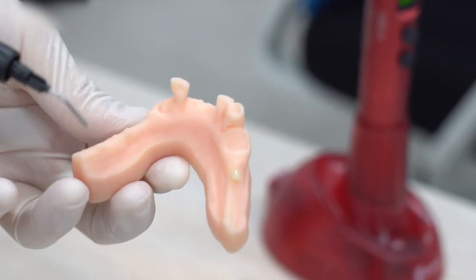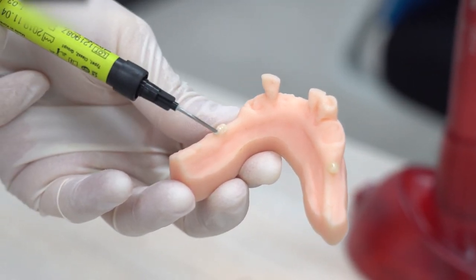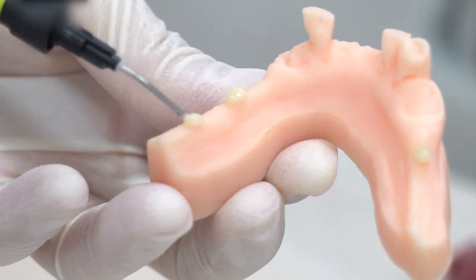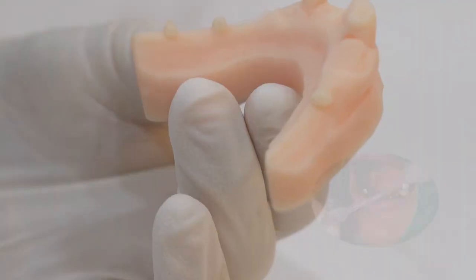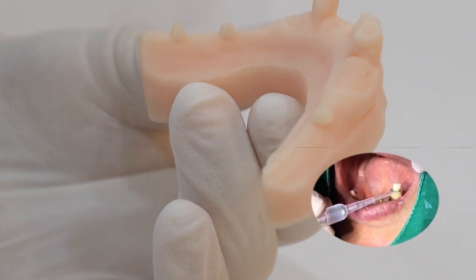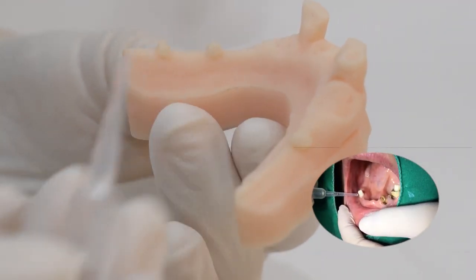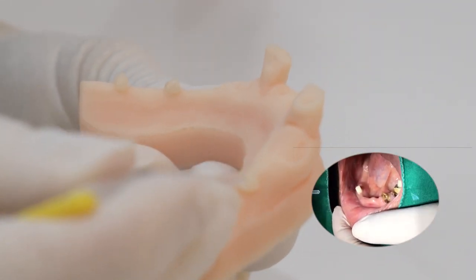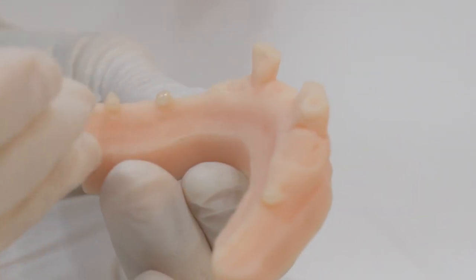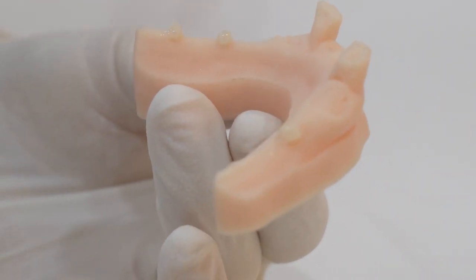I will now harden it with the curing lamp. Always note that if the resin isn't high enough, it is hard to determine the location in the CT. After the resin is attached to the gum, add histoacryl. If you put one drop of it after curing the resin, it will fix the resin even harder. It will automatically stiffen after 2 to 3 seconds.